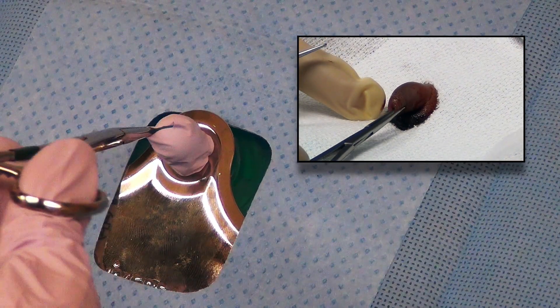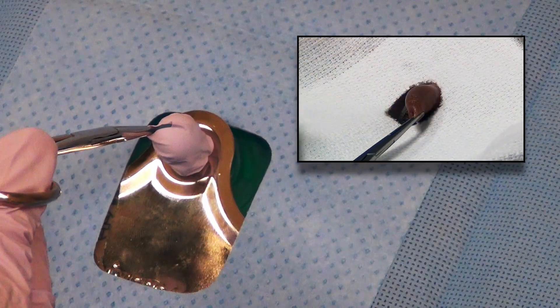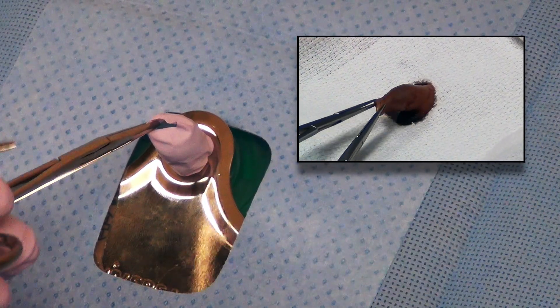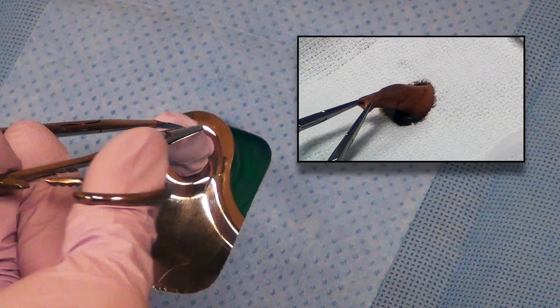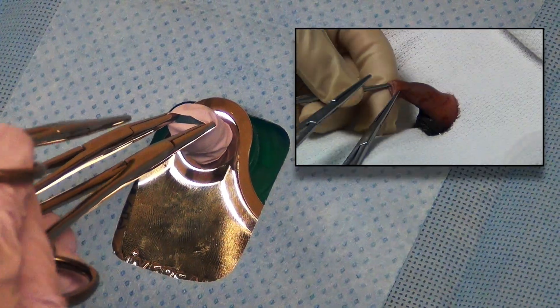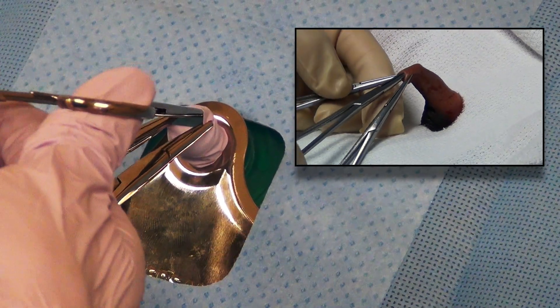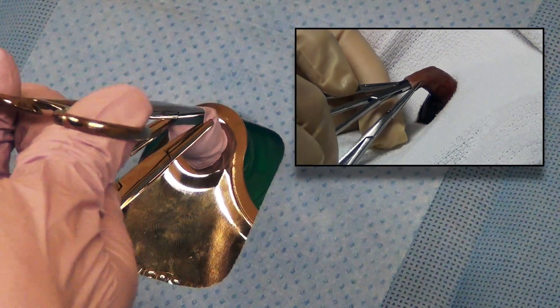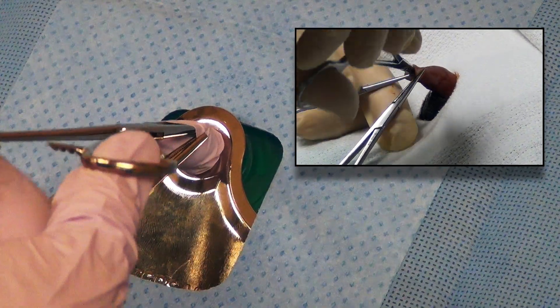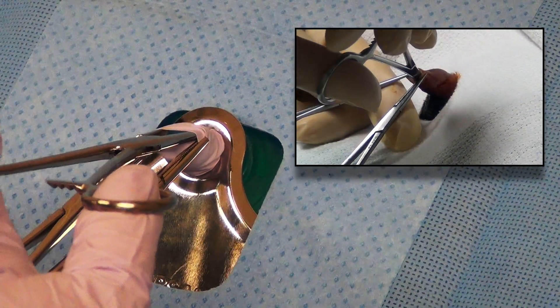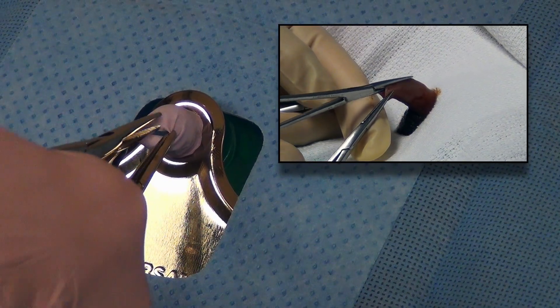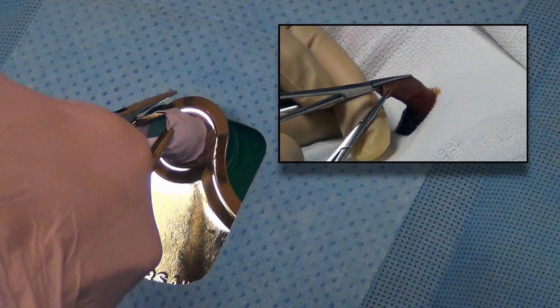Again, the foreskin is grasped at the 3 o'clock and 9 o'clock positions. Adhesions between the glands and the foreskin are broken up with a hemostat.